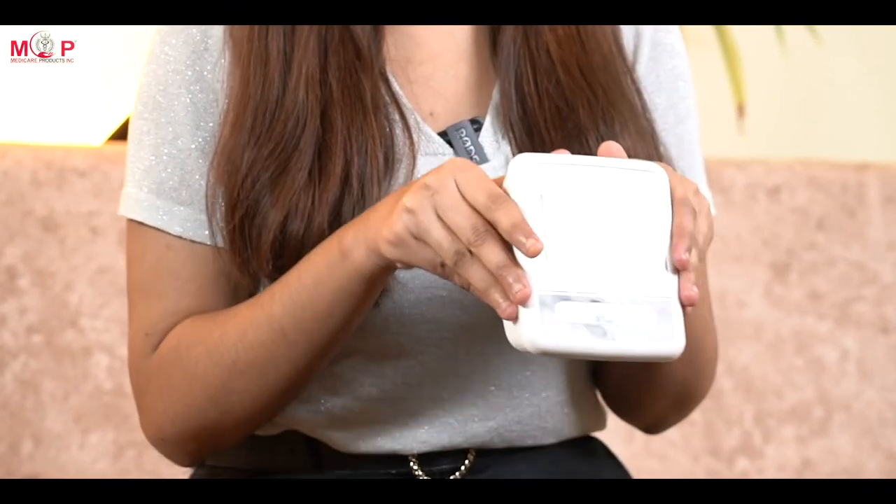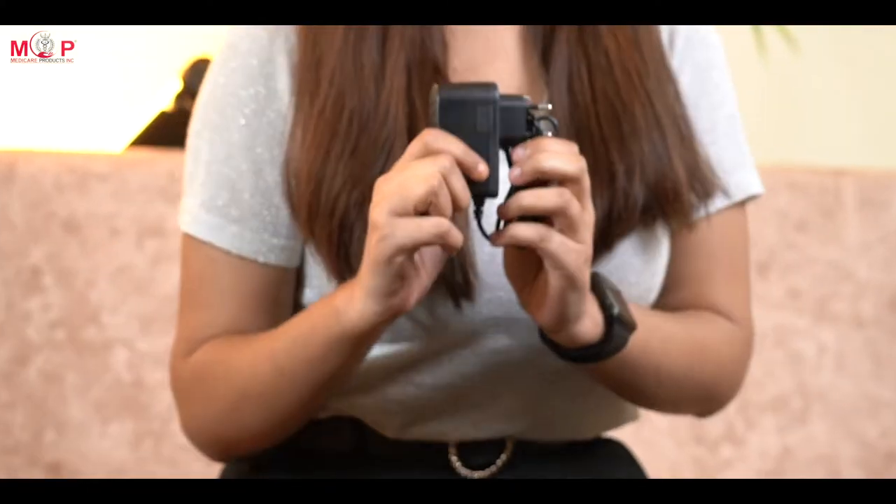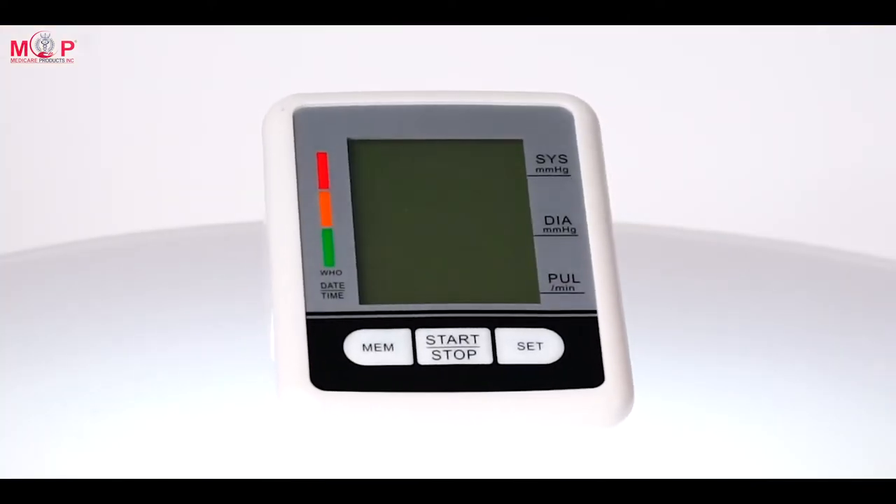Now let's understand the product. Firstly, we have a BP unit, a cuff with the tube, an adapter, and an instruction manual. The instruction manual helps you understand the instructions better and follow the precautions.